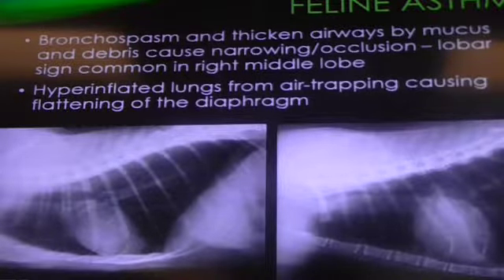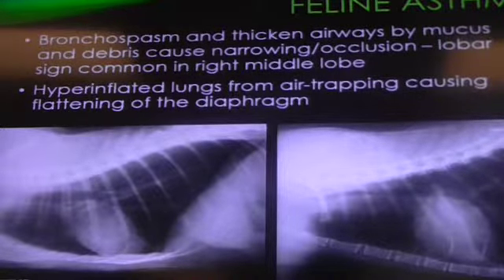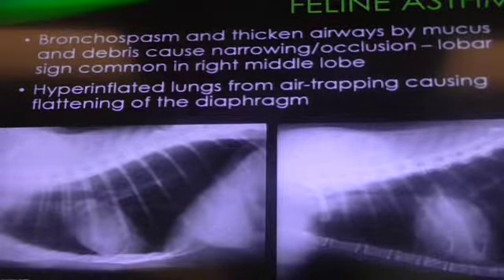Yeah. So like on one of the Joseph's questions, it was kind of sort of asked that, and it was saying that you would say it's the left there and right, just because of the compression. Yes. The most of it is the left side. But it doesn't mean that you are not seeing the right side. So if there was a lesion, so if the nodule, for example, is on the left side, it will be more obvious on the right side recumbency. Because the left side has more air and the lesion is more prominent. We'll cover that concept later on. But just to get you started, good?